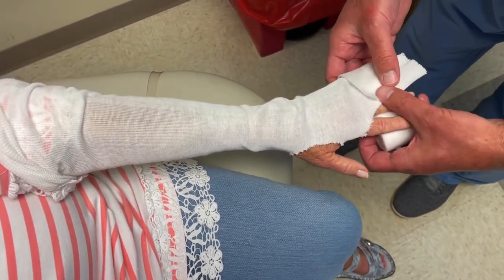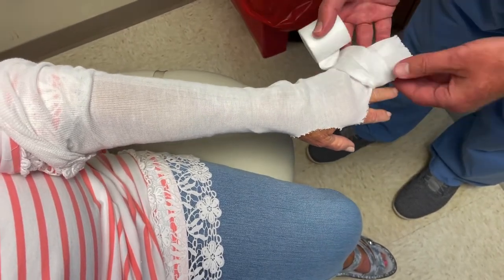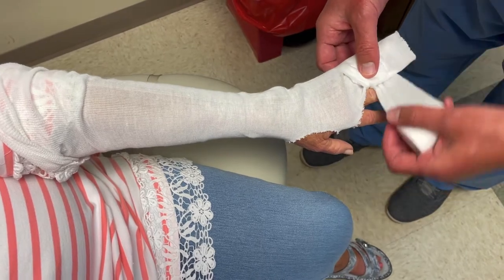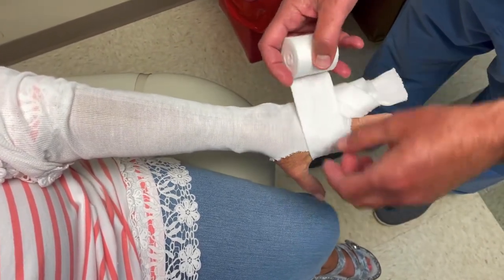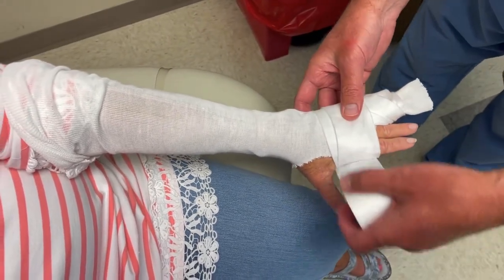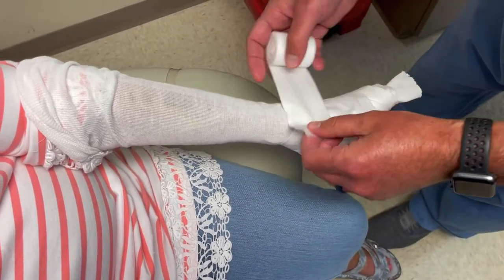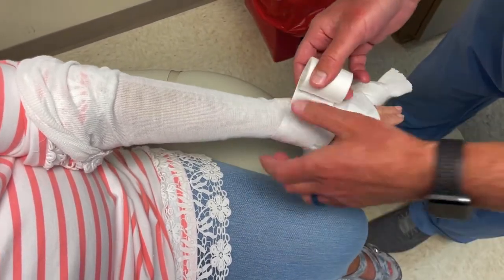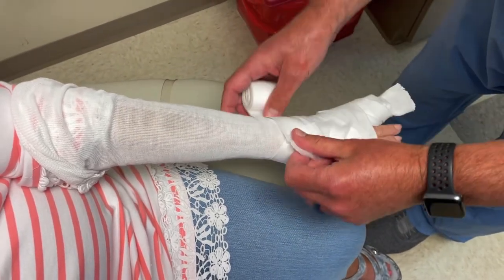These two fingers go together like this — go plenty of thickness here. You're gonna go up around the hand a few times. Don't be afraid to put it pretty thick because you don't want any areas that are gonna be a problem. Especially around the wrist here where the ulnar styloid is — that can sometimes rub on these splints.